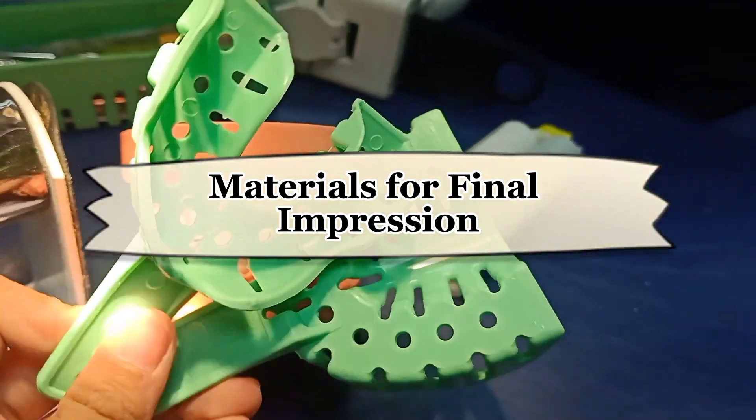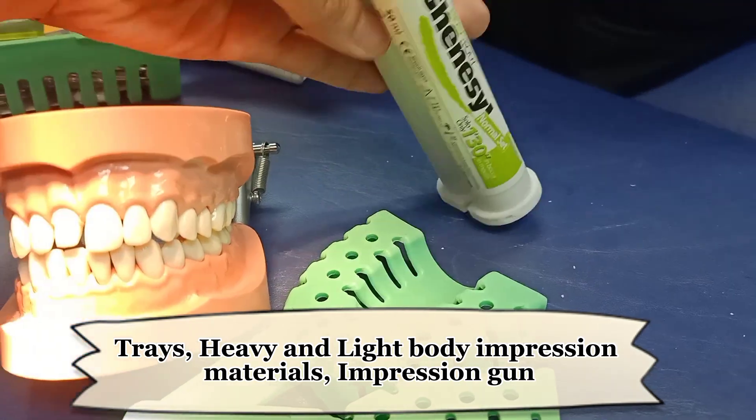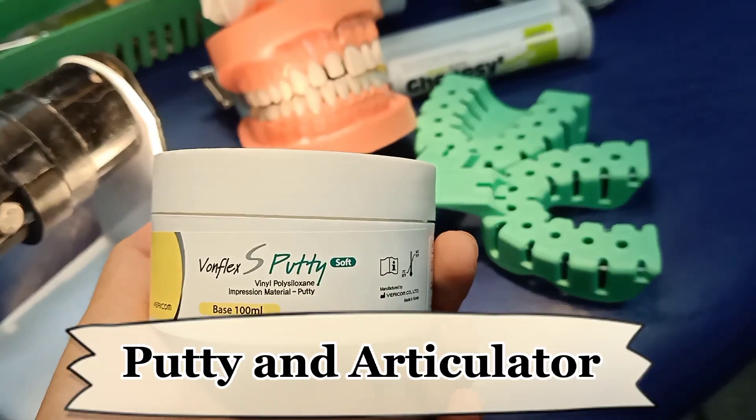Materials for final impression: trays, heavy and light body impression materials, impression gun, putty and articulator.